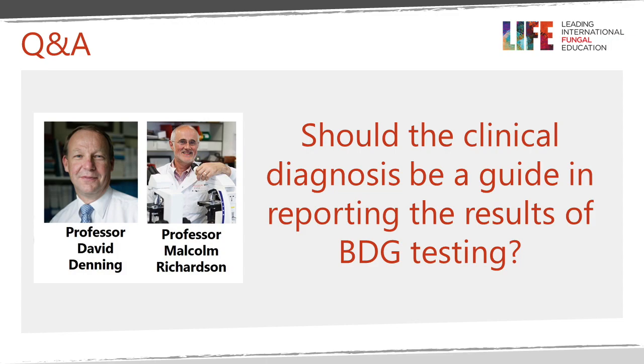It's called Fungitell STAT, and this is for single samples. So it's going to be interesting once we are able to get our hands on this, how it's going to perform. The comparative performance data looks good in the paper, which came out in an issue of Medical Mycology very recently this year. It'd be quite interesting to see how that performs in a routine setting.